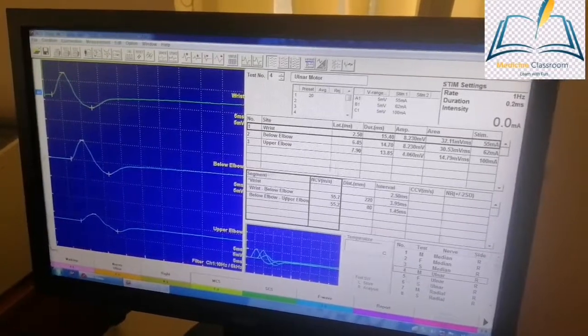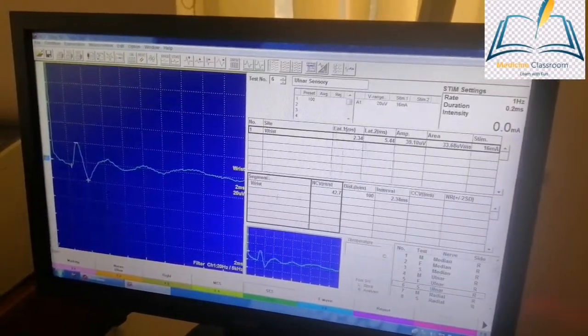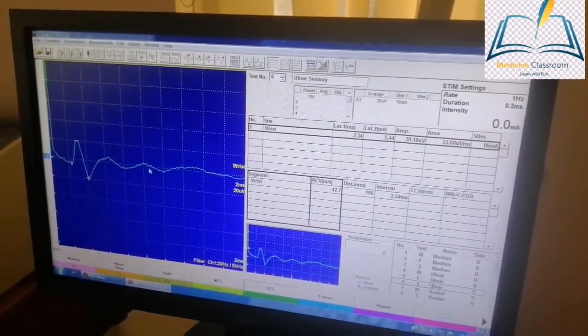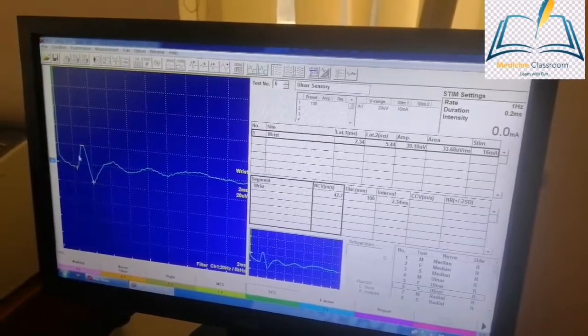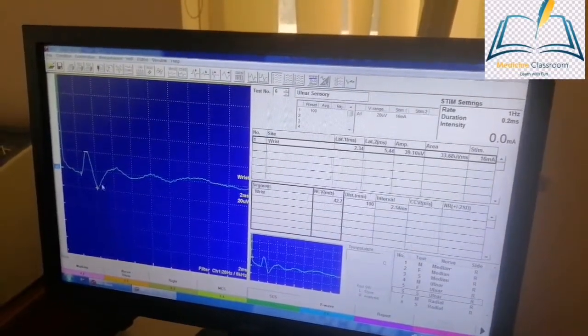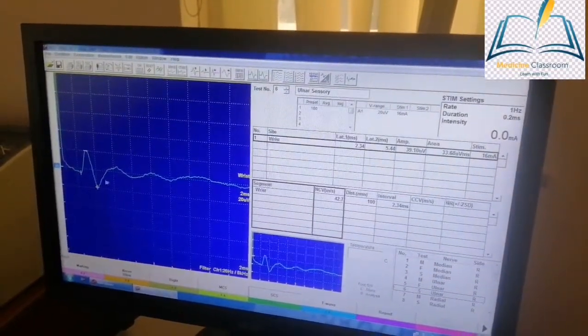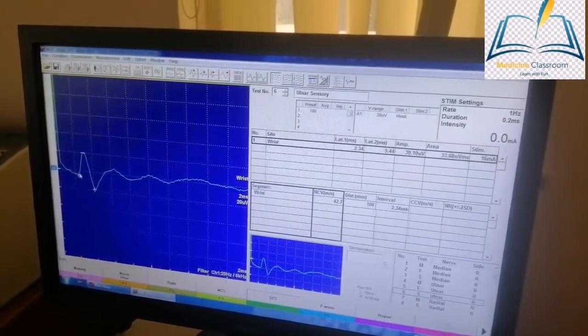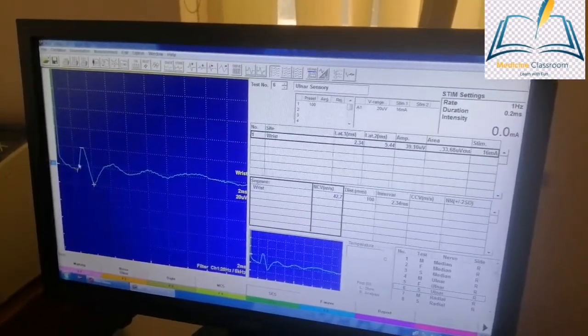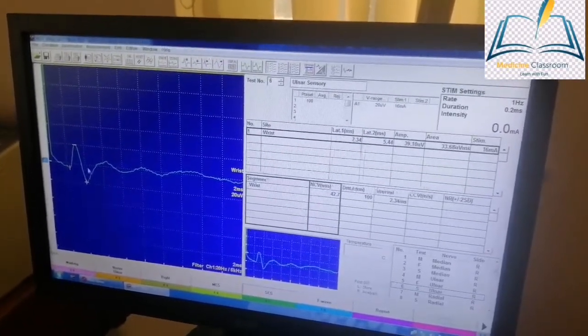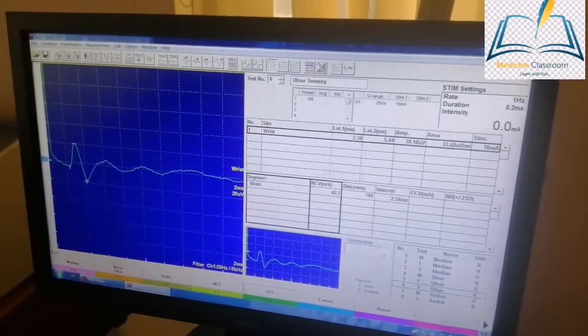Let us see the sensory study of the ulnar nerve. You can see there is a very nice sensory nerve action potential and it's normal for the ulnar nerve. Usually in a patient with GBS, sensory findings are usually normal.